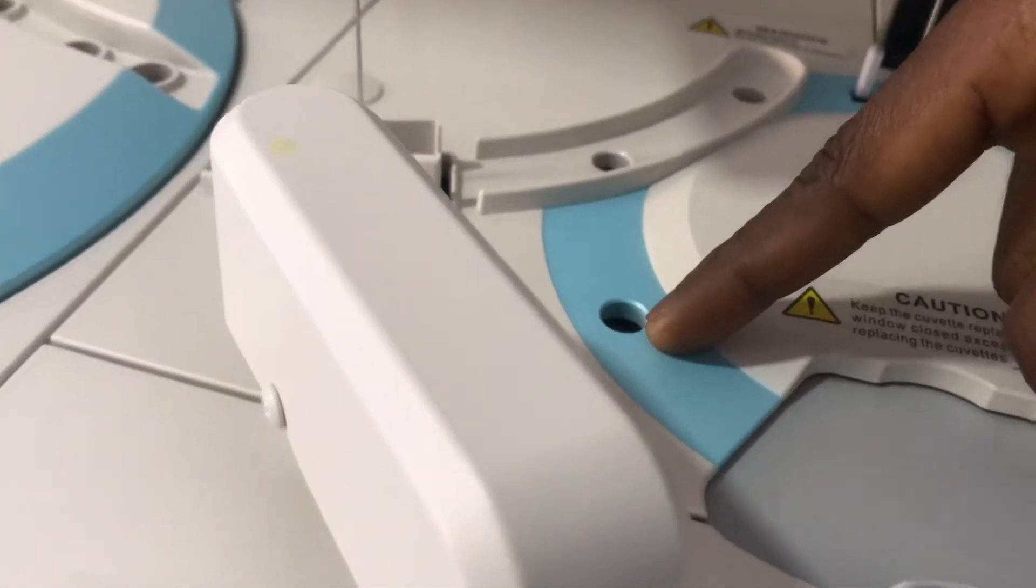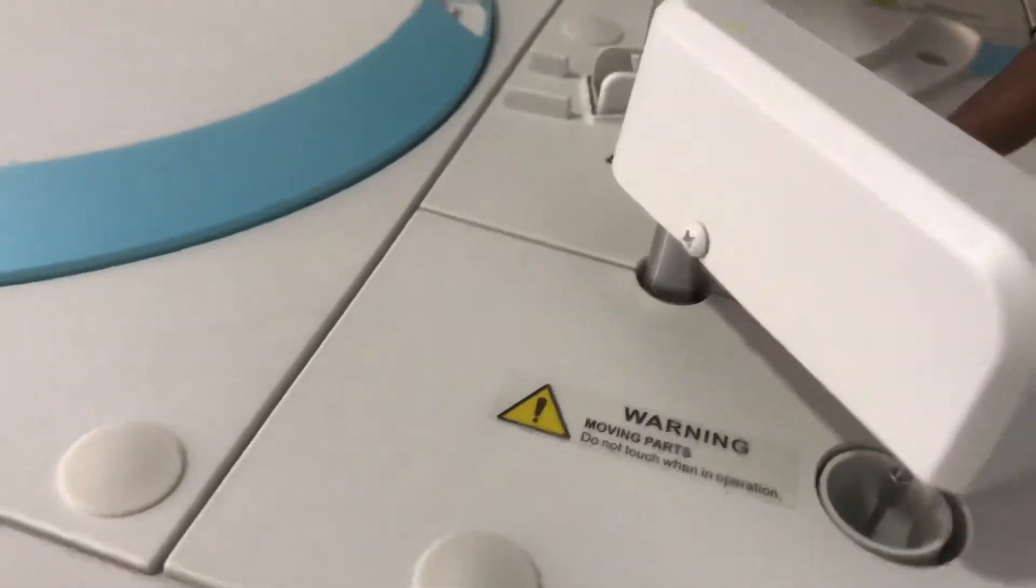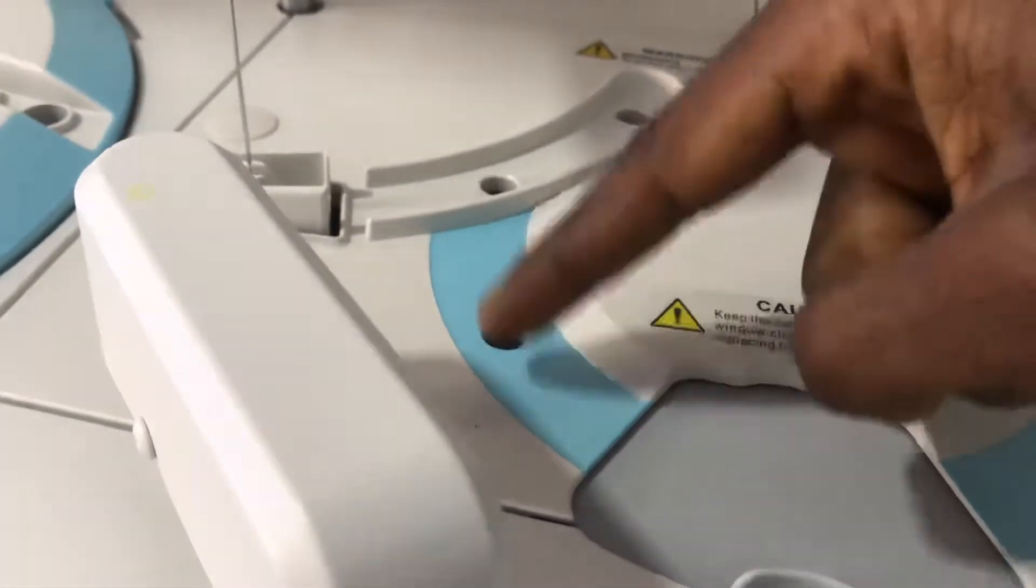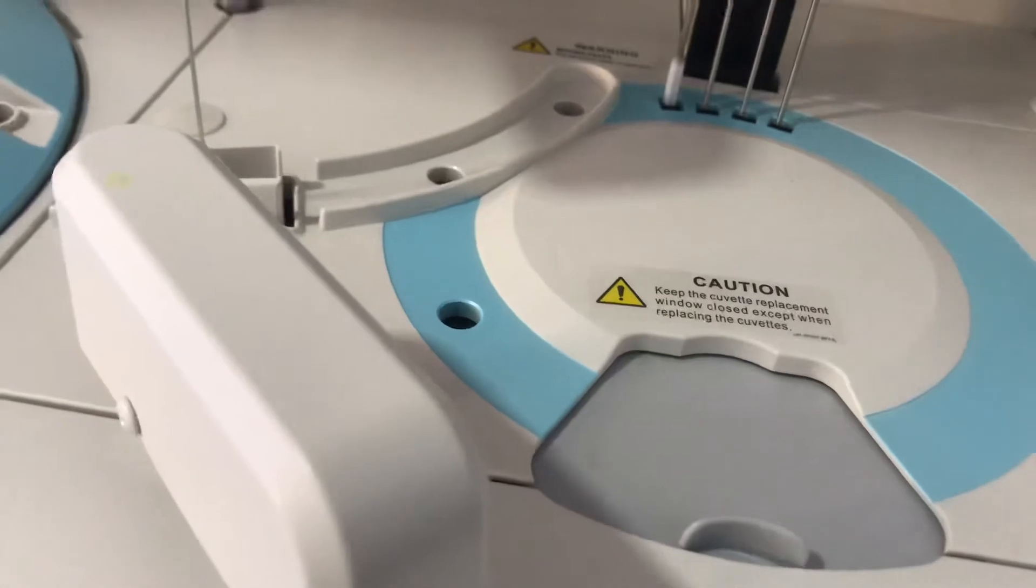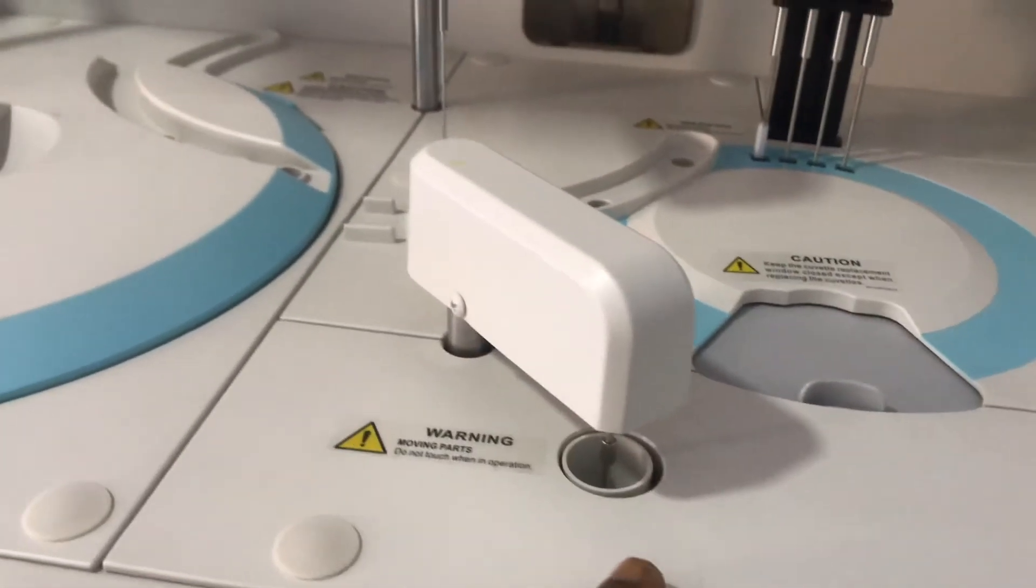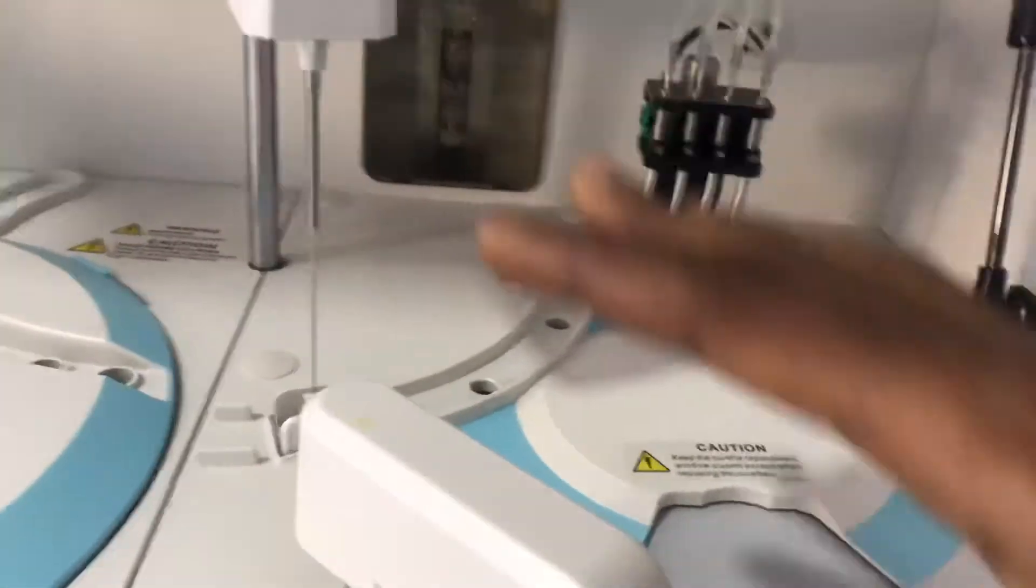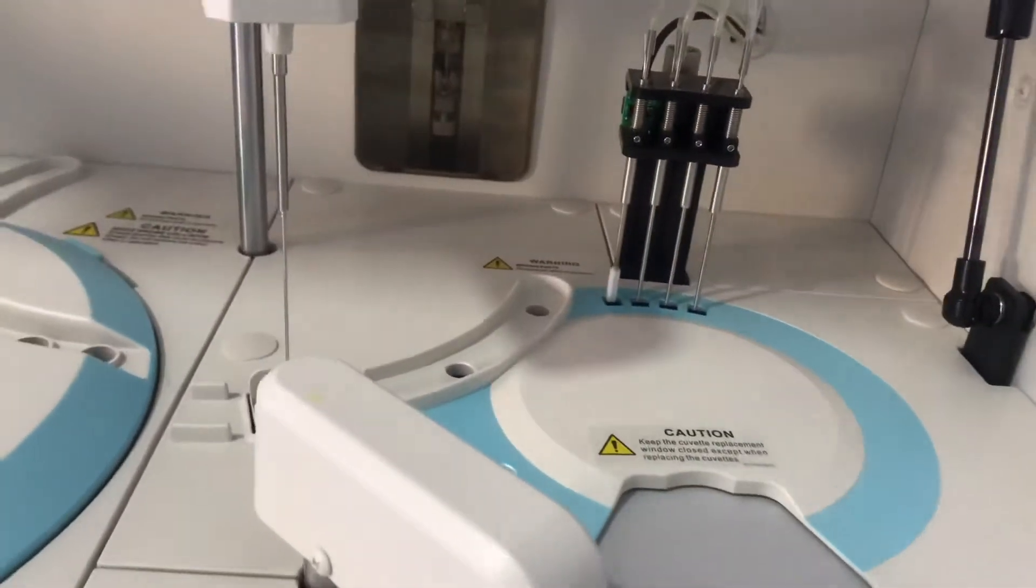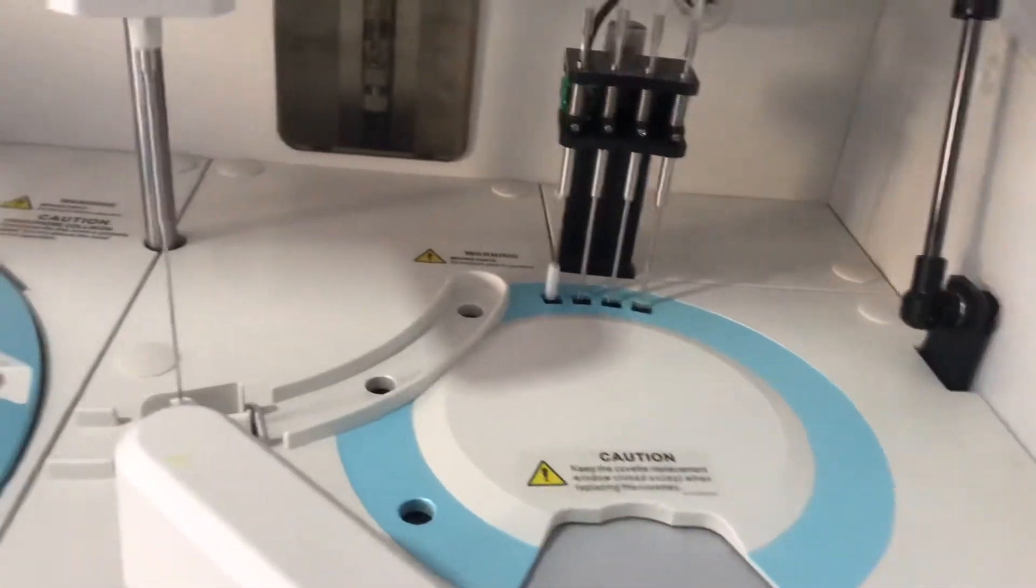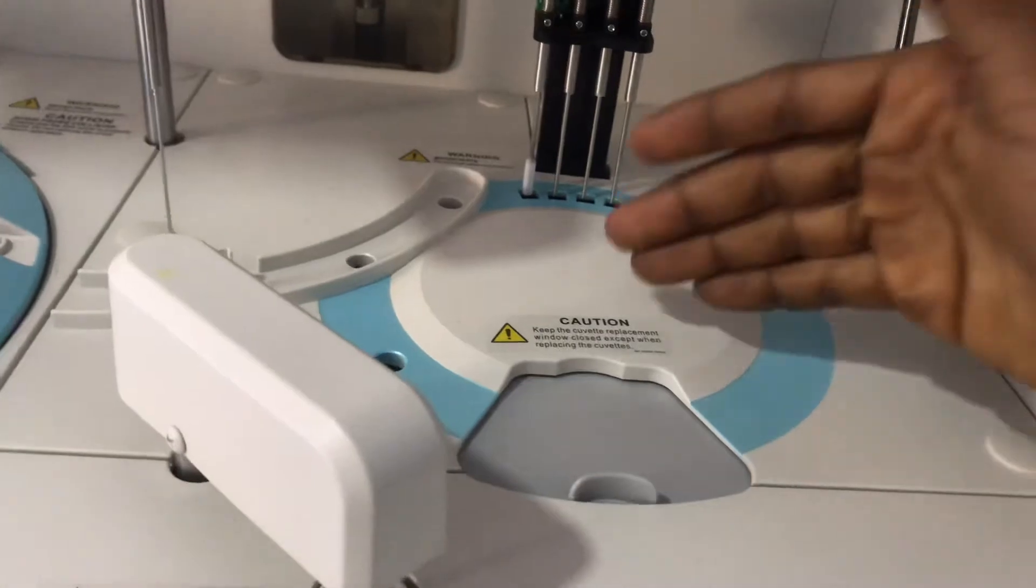This is where the mixing actually occurs. It moves to this position and then the mixing is done, and then it comes back to the wash well where it gets washed. Now let's come to this side of the machine.